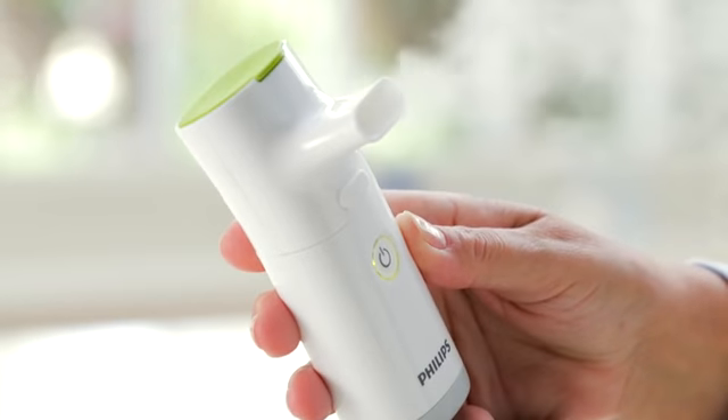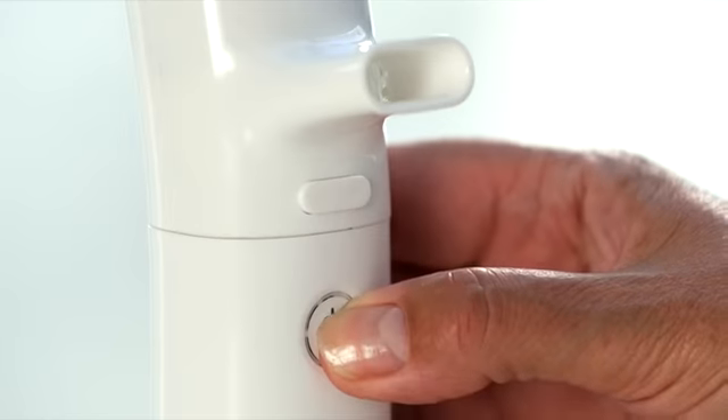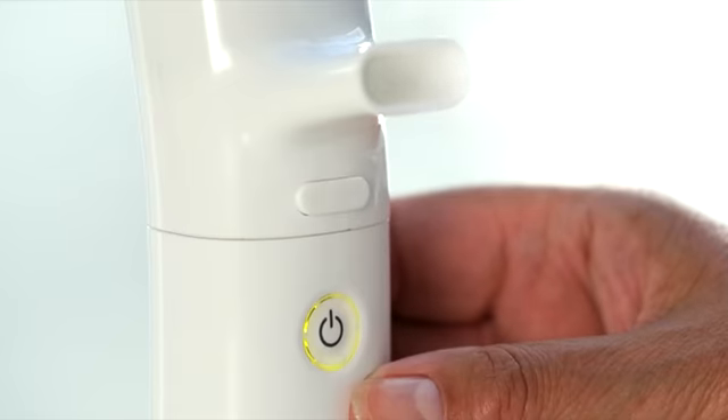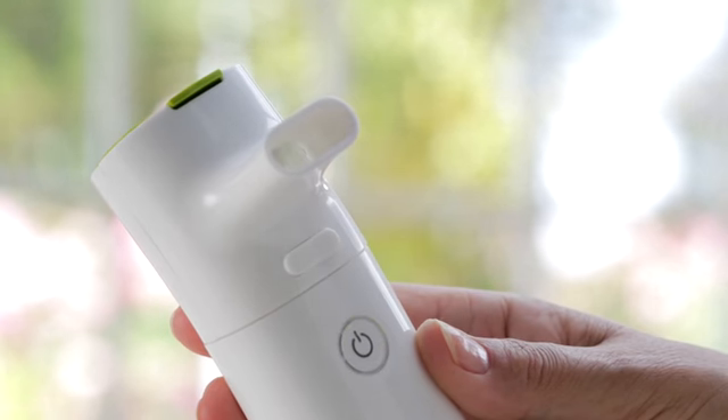If you need a rest, just press the on-off button to stop your treatment. When you're ready to continue, press the on-off button again. Your treatment will take about four minutes and is finished when the nebuliser beeps and the light flashes. The device will then turn itself off automatically.